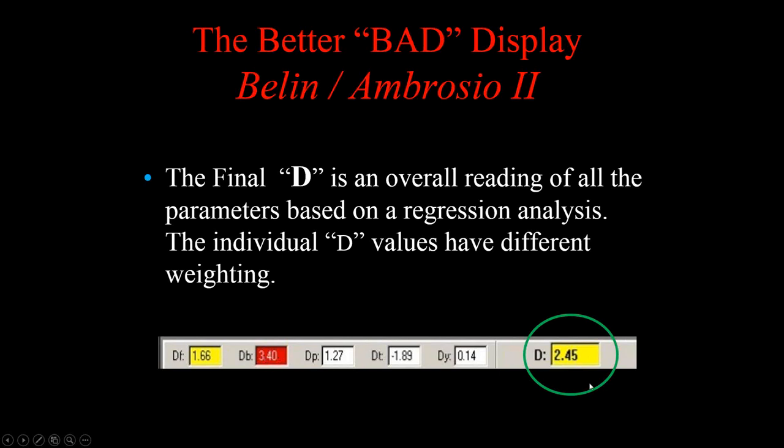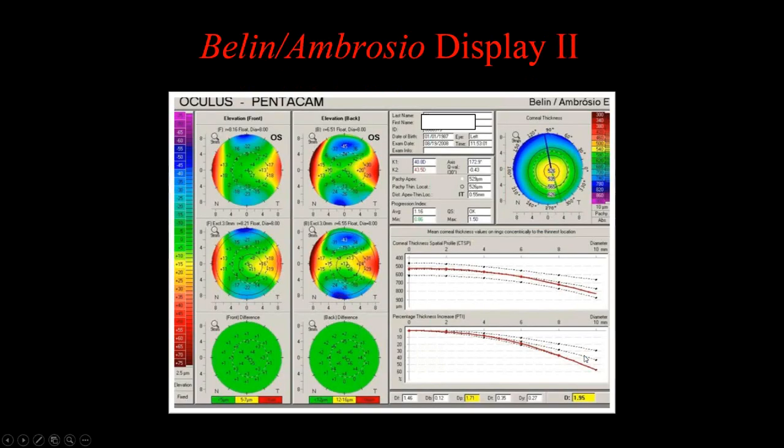You may have all whites here and have a yellow here if all these are borderline. This has predictive value. This has been validated. These are just standard deviations based on a normal population. I always use the example of glaucoma. If someone comes into your office with a pressure of 22, yes, that's outside of, quote, the 95% confidence interval. But they have a cup-to-disc of 0.1, no field loss, no family history, and a normal nerve fiber layer. You have a yellow for pressure, but they don't have glaucoma. So don't overread any of the individual parameters. It's the global reading of the map that is important.